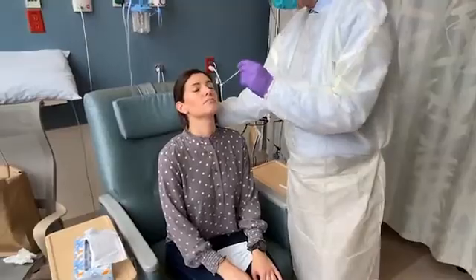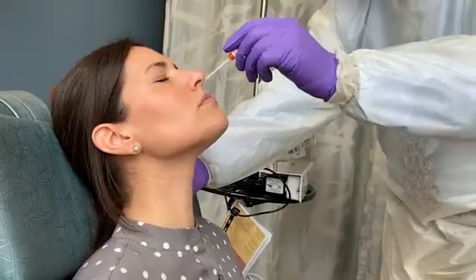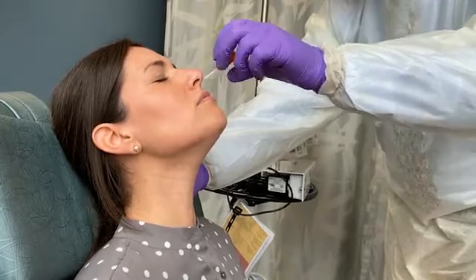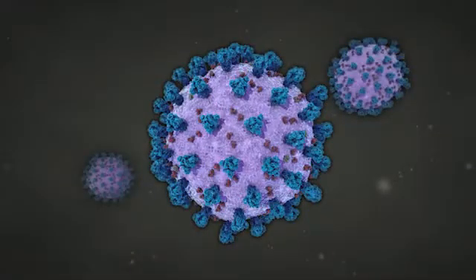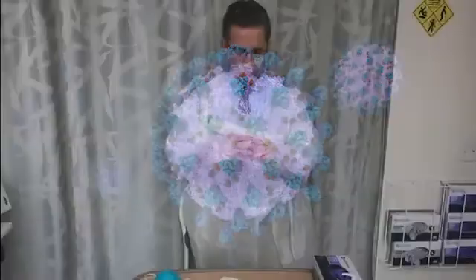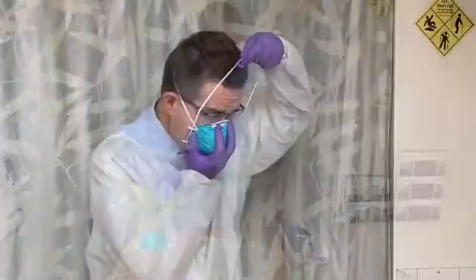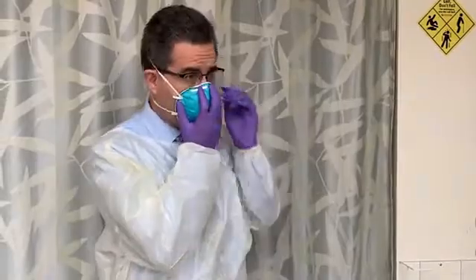This video has demonstrated how to collect specimens from the surface of the respiratory mucosa with nasopharyngeal swabs in order to diagnose COVID-19 in adults and in children. As shown, it is important to use approved PPE and the appropriate technique to minimize the possibility of spreading the virus.